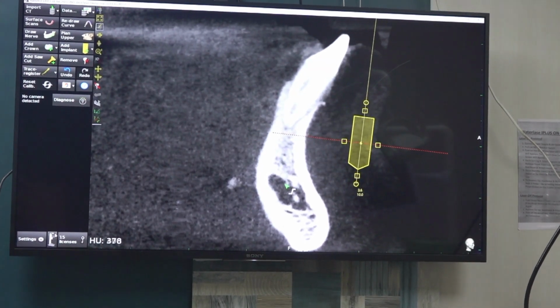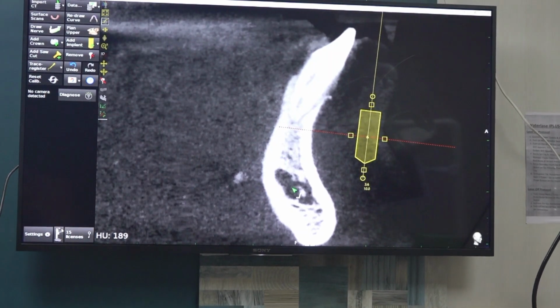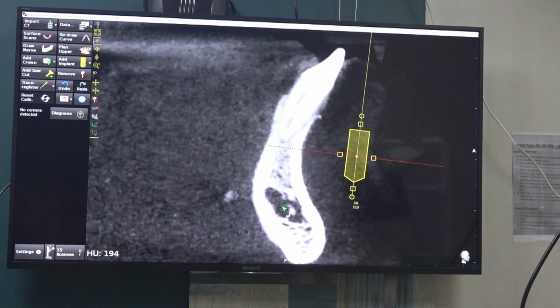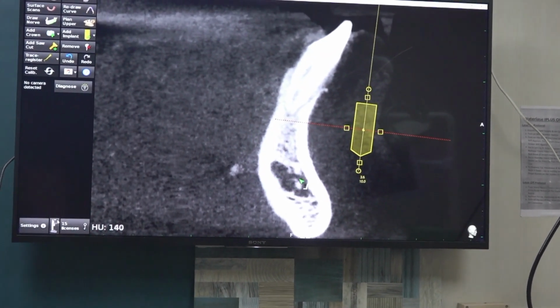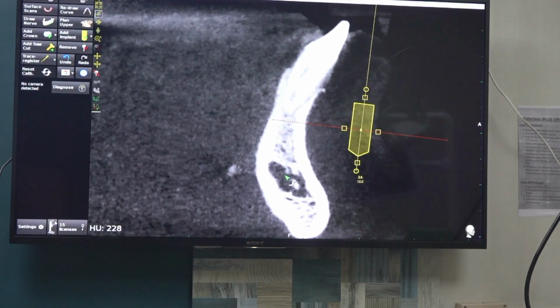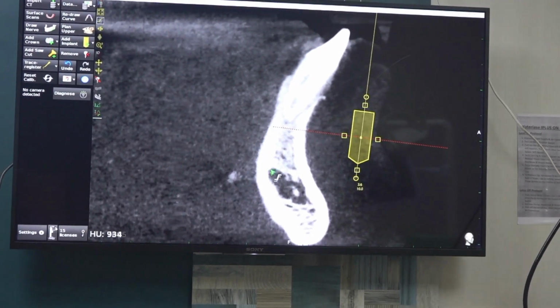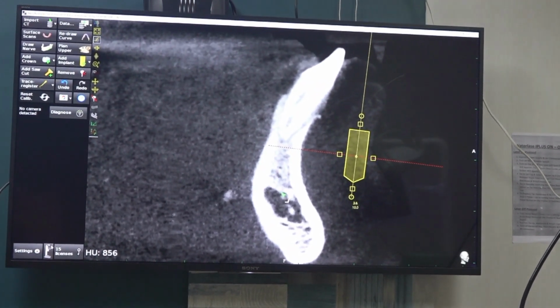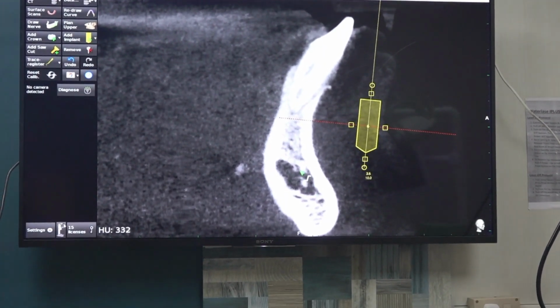There are two disadvantages. If you go till here, you may get a stability problem. Also, if the mandibular incisive canal is impinged, it may give pain. And if there is an artery and vein going through it and you induce bleeding, it may lead to bone loss and periapical implantitis, apical bone loss around the implant.